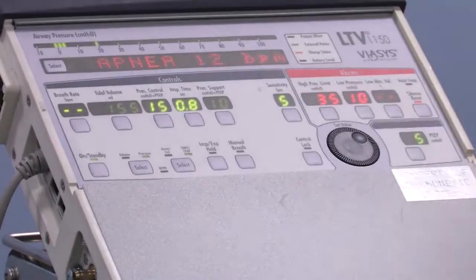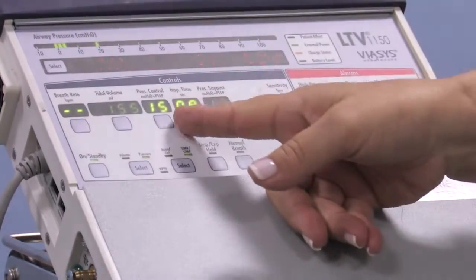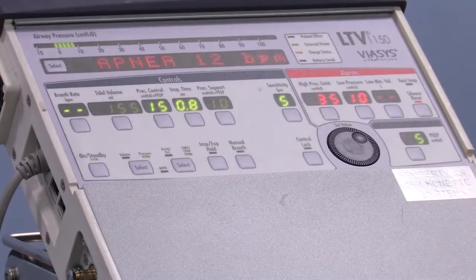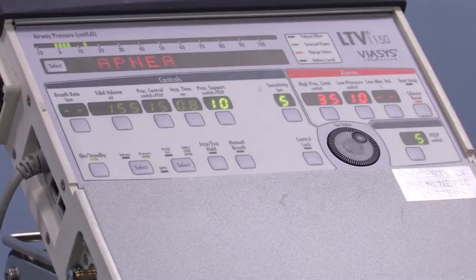So what you're seeing now, you heard the audible, you see apnea 12 breaths. The pressure support went out. The mandatory breaths are firing. This is the up to 20 down to 5, or 15 of pressure control over the 5 of PEEP, 12 times a minute. Once the child takes 2 breaths, this goes out. They're back in pressure support where they were, but it's saying apnea. So if you're in another room and you come in and you see it just saying apnea, the child violated the apnea timing, but started breathing again, and it's gone and reset since you got there.